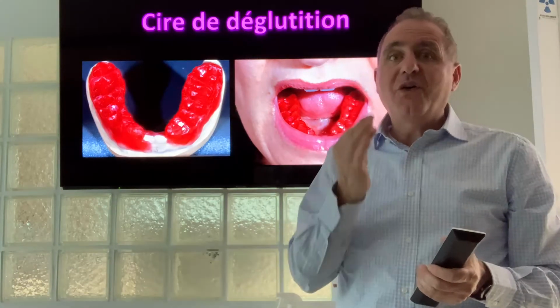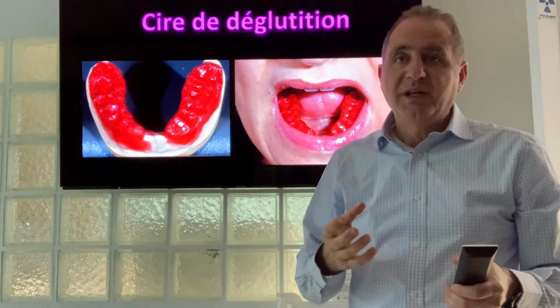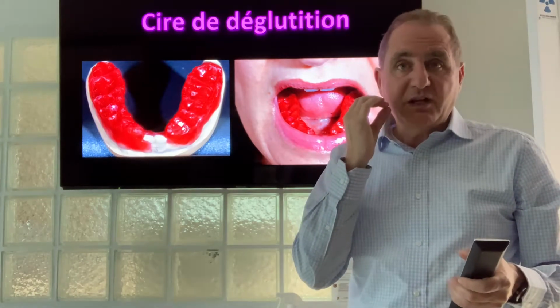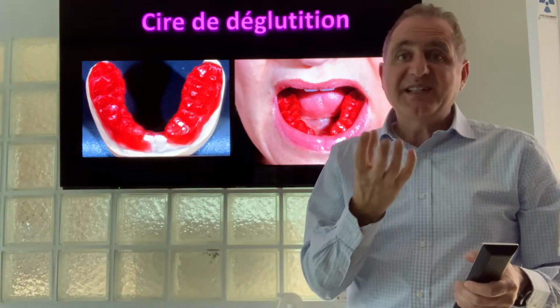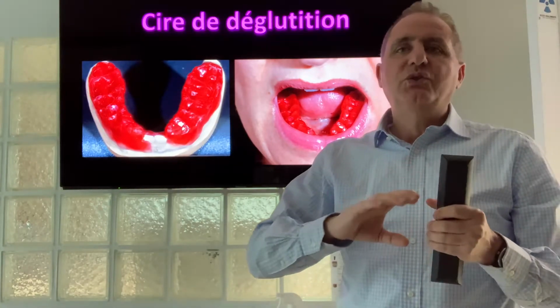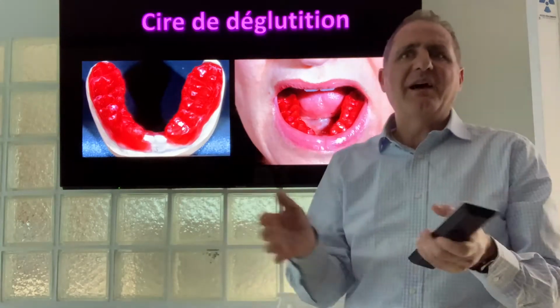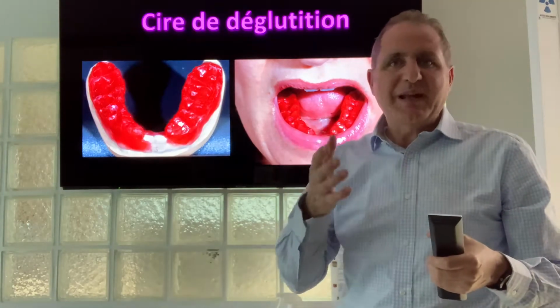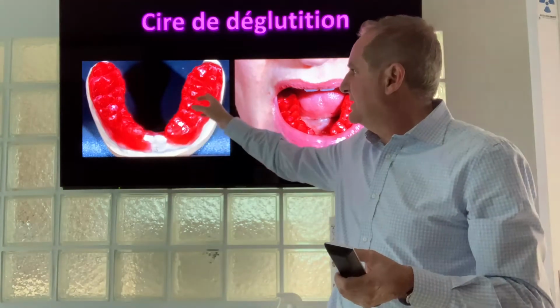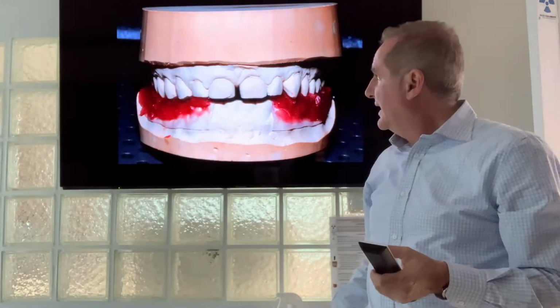It's the only time that your teeth touch together in your life, just when you swallow. And when you swallow, your back teeth, the posterior, will touch and will give us this nice physiological posture. So this is the way. I don't want to make it so long. Just make it quick, and once you do my training, you will have all this information and how we do it, and I will explain exactly in reality how it is. Okay. So assume that everything is okay. So this tender wax will register for me the relation between the upper and the lower. And this is it, okay?